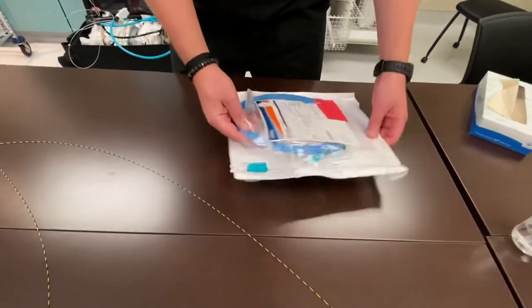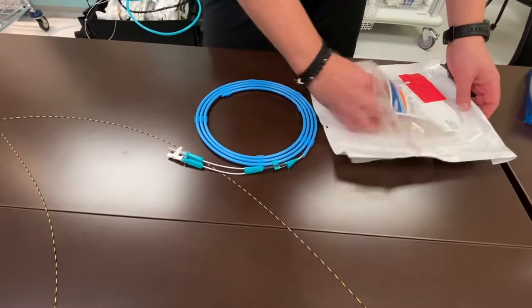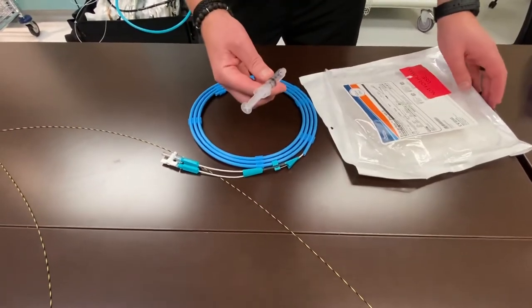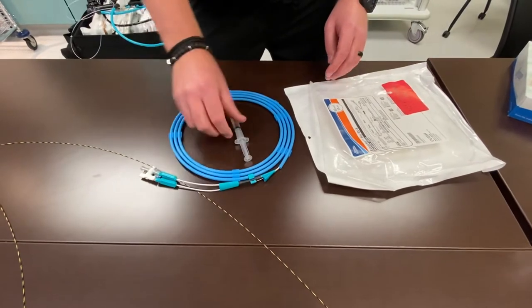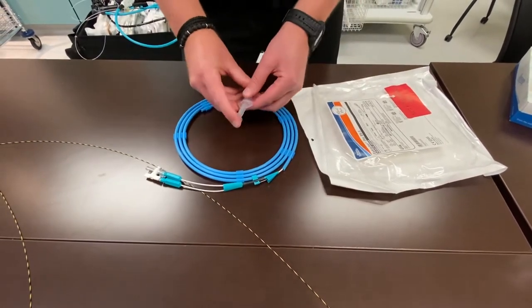After you open the package, you're going to remove the blue hula hoop, and you're also going to need to find the syringe. The syringe that comes in the package is specific to the balloon, so you have to use the syringe that comes in the package.